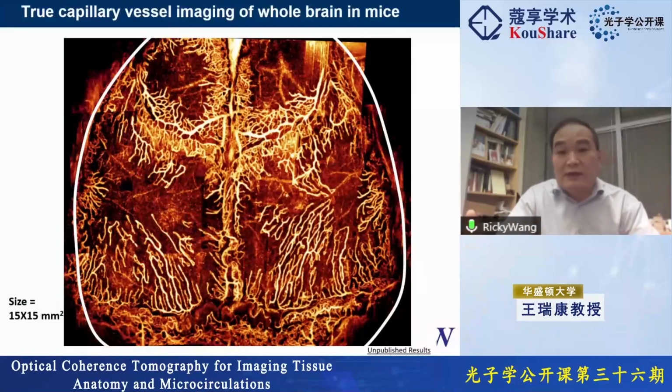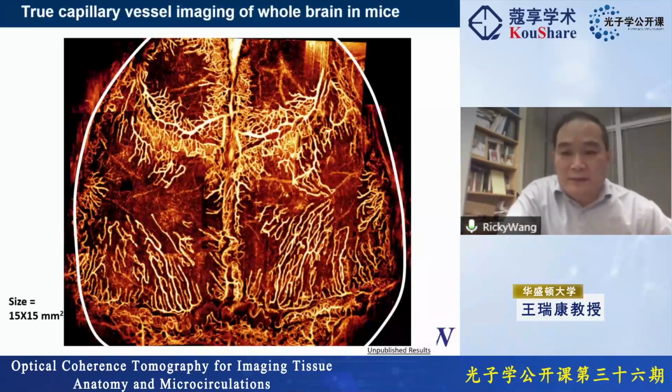With dilation of the vessel, the pain sensors will feel it, and therefore you get the headache. This is the category of migraines. Migraine is a huge problem in society. So if you use OCT, it may shed some light on migraines, right?